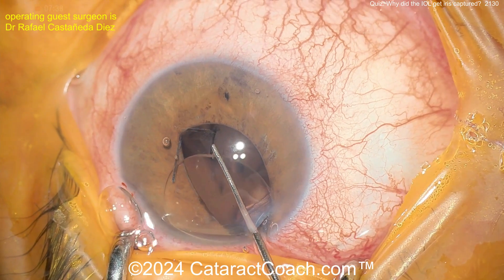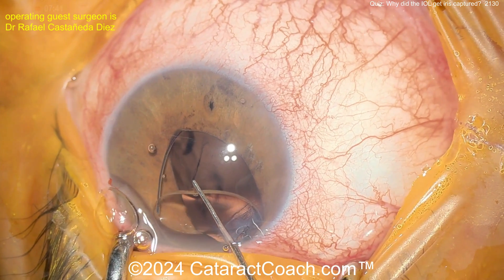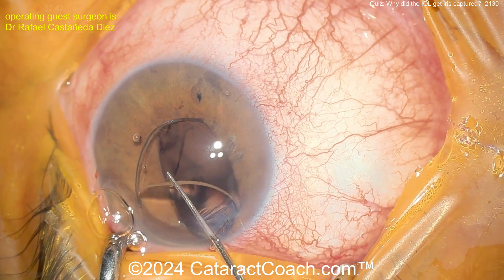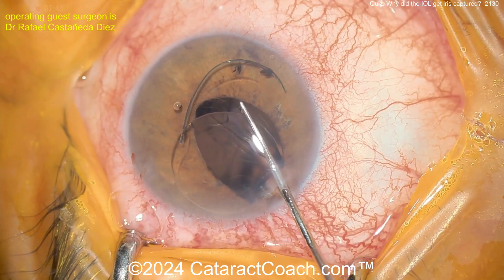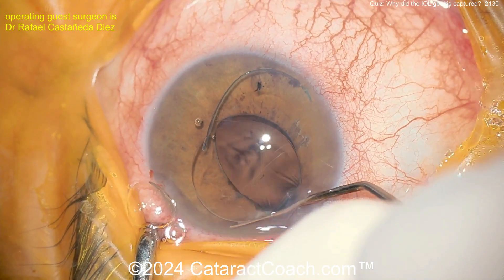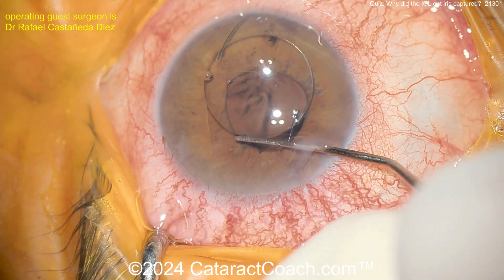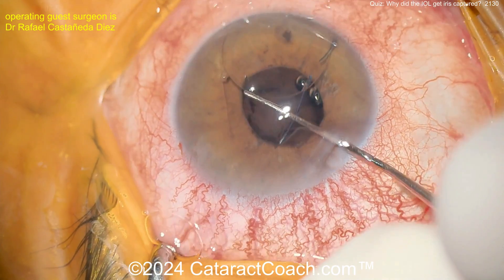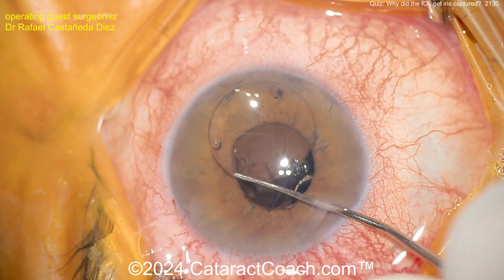Maybe pulling that lens around — get that lens up; don't let it fall into the vitreous cavity. I like that, that's a good idea. One haptic now above the iris, maybe get the other haptic up. Maybe you want to do an IOL exchange, or do an iris claw lens — although not in America because we don't have that lens.